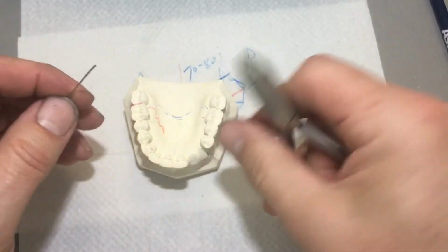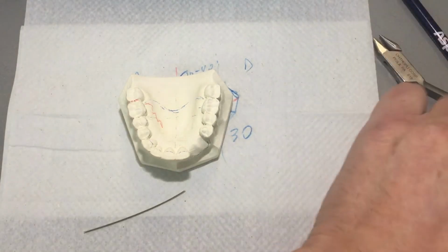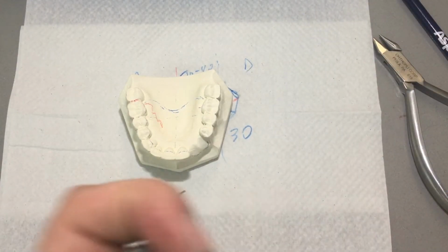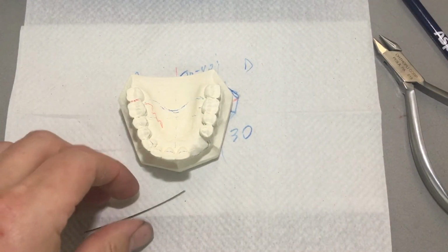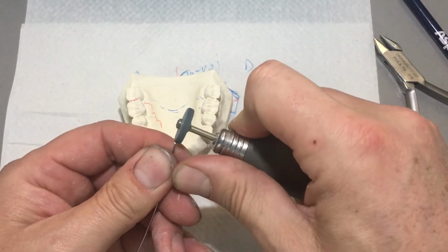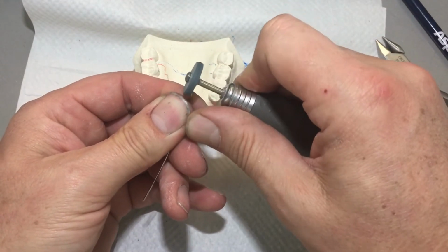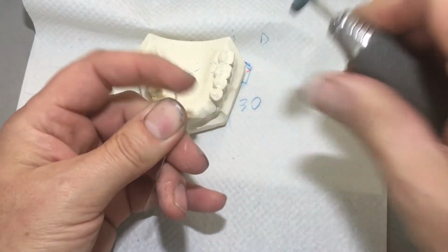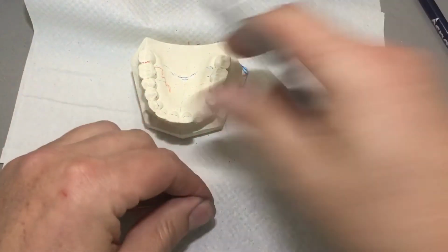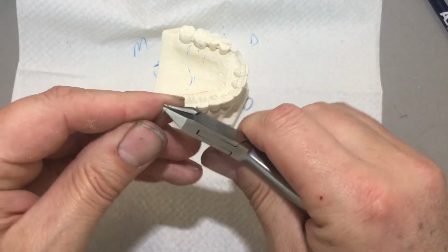Nick, meaning the tip came off. So naturally, I would start with my handpiece and polish the tip of the wire. You can do this before or after, but I would take a rubber wheel and just round off the end of the wire so it's nice and rounded. Choose which one you're going to do first. I would start by bending the end.